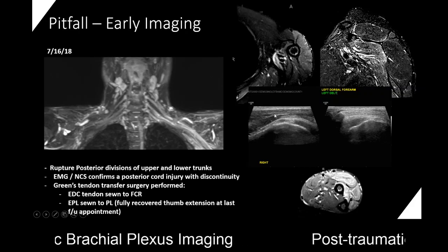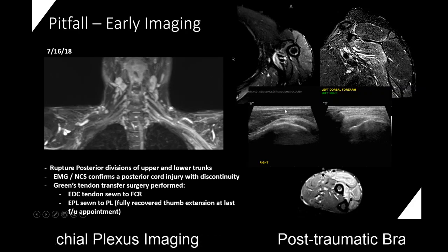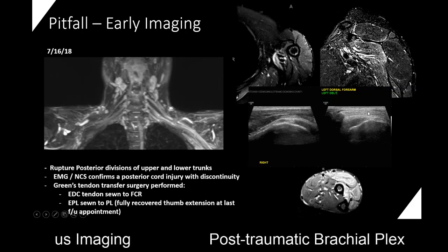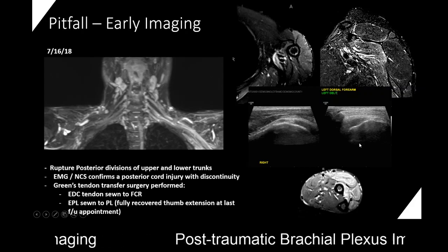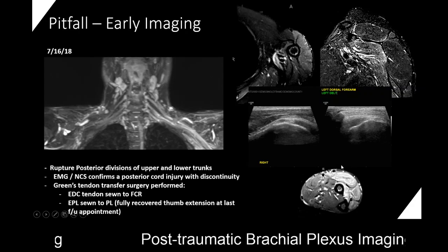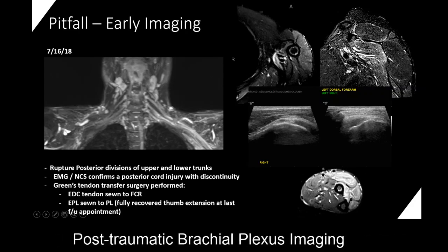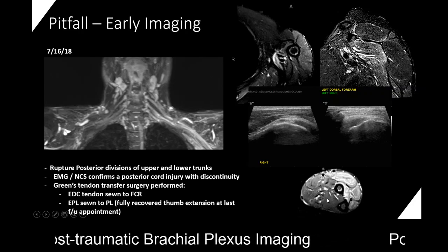We look at the deltoid on the unaffected arm. You see normal hypoechoic muscle and bulk compared to the affected side where it's echogenic and we've lost bulk. Downstream in the forearm extensor compartment alone, you have denervation change compared to the volar, which is going to be median and ulnar innervation.